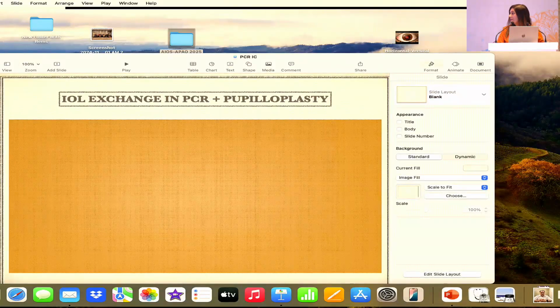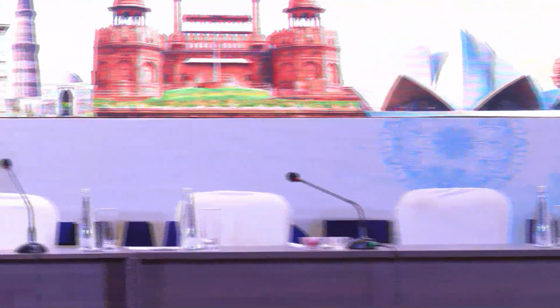Dr. Priya, excellent array of cases. I just have one reservation with the IOL scaffold, particularly in the cases that you had shown. Particularly when you're doing a 3-port pars plana and you're going to do a posterior vitrectomy, do you think it would be safer to do a lensectomy from behind rather than dragging the nucleus in front, putting an IOL behind and doing a phacoemulsification above it? Because our cataract surgery outcomes have improved, I think the lensectomy outcomes are equivalent to almost phacoemulsification.